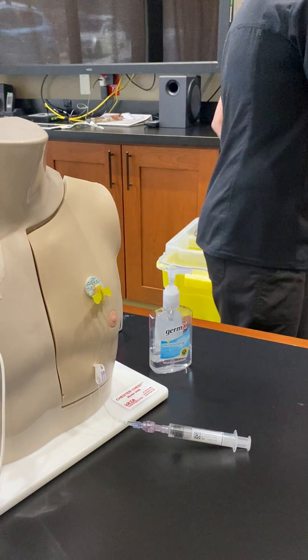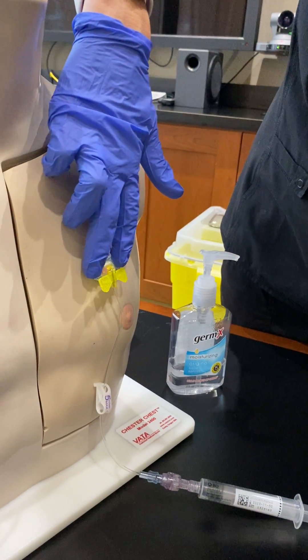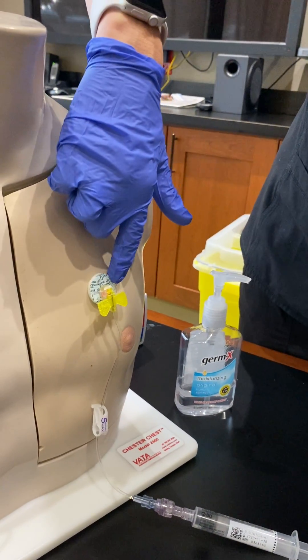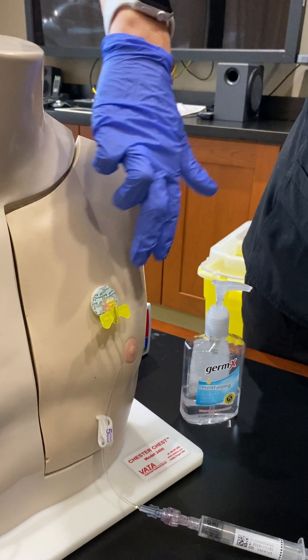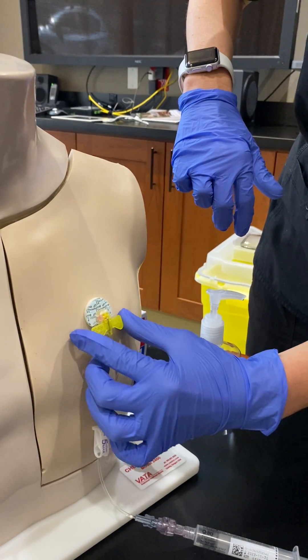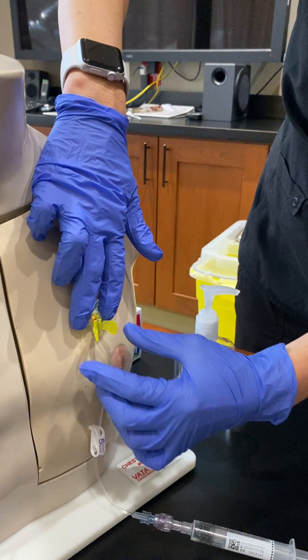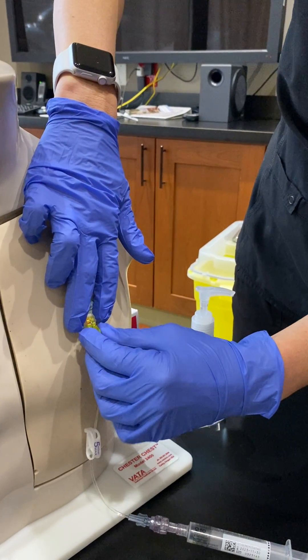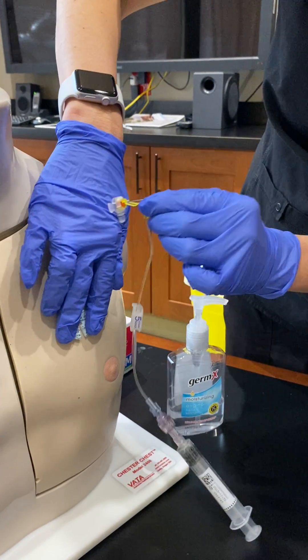When you go to deaccess, you will put two fingers on top of the clear wings as shown in the first video — that is what is going to activate your safety. You're going to use your other hand to take the yellow wings and hold them up against the skin, then pull back. You'll hear a snap, and that snap is what engages the safety.